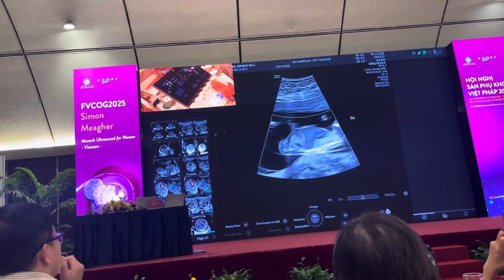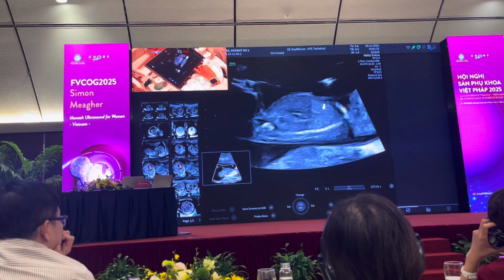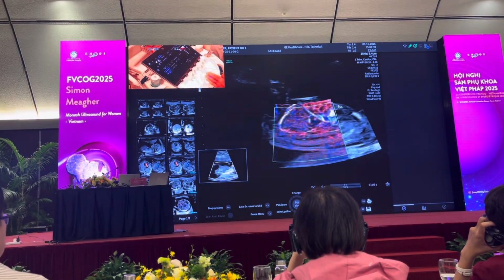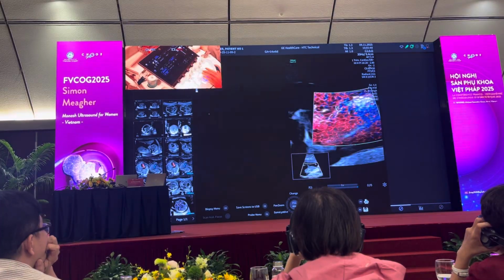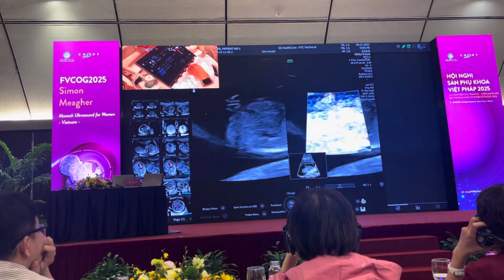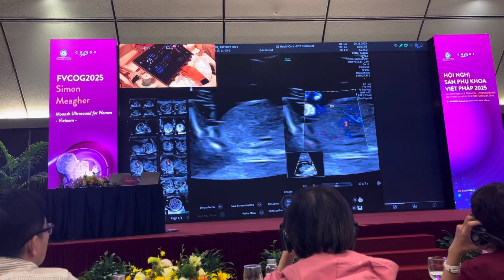When you take a sagittal section of the baby, you can see the diaphragm here, the lung fields which is brighter, turn down your gain, and you can see the anterior abdominal wall. Once you've got the anterior abdominal wall in view, you can then move to slow flow and split your image in two, and then you can demonstrate your intrahepatic vein. As you follow down to the ductus venosus, you turn down the gain because it's very, very sensitive. And when you turn down the gain, it may help get rid of background interference.